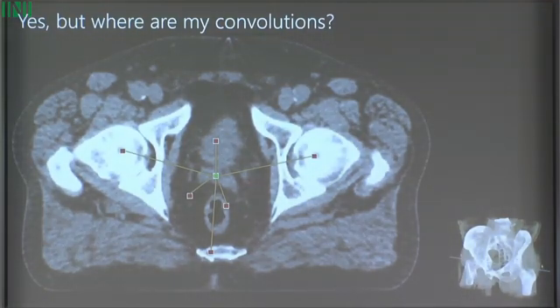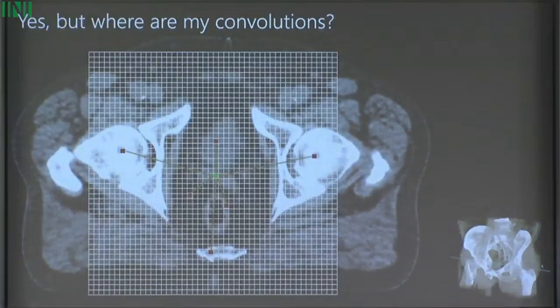So this is another form of deep learning. So the question to ask is, where are the convolutions, right? Because that's what we see over and over again when one does regular deep learning. So what the forest learns are actually very sparse convolutions. If you look at these probe voxels, which are learned automatically, they actually correspond to convolutions which are fairly lightweight.